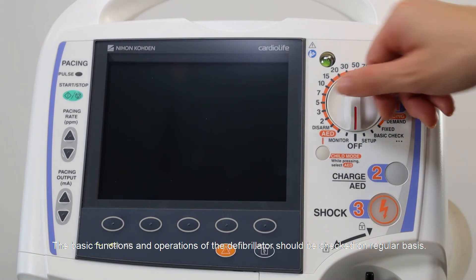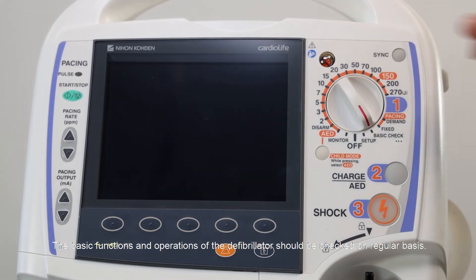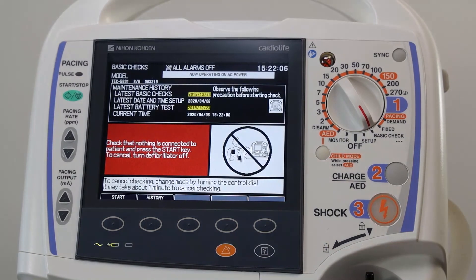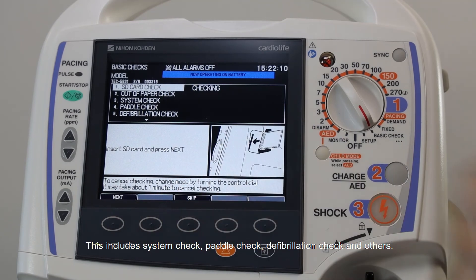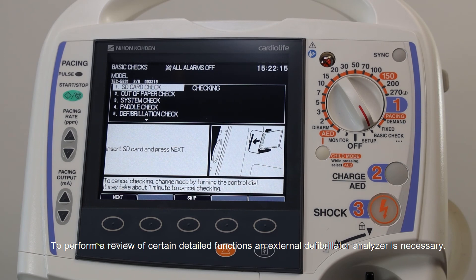The basic functions and operations of the defibrillator should be checked on a regular basis. This includes system check, paddle check, defibrillation check and others. To perform a review of certain detailed functions, an external defibrillator analyzer is necessary.